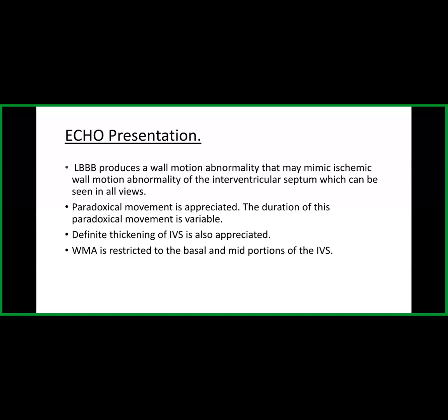In addition to this, there's also complete dyskinesia of the septum. It is also important to note that in some subjects, this paradoxical movement is so transient, so quick, that it appears as a small jerk inward and outward of the left ventricle. I will show you what that looks like in the next slide.